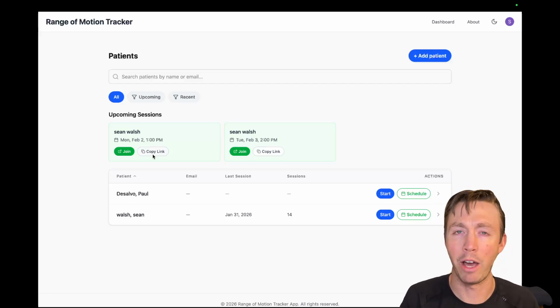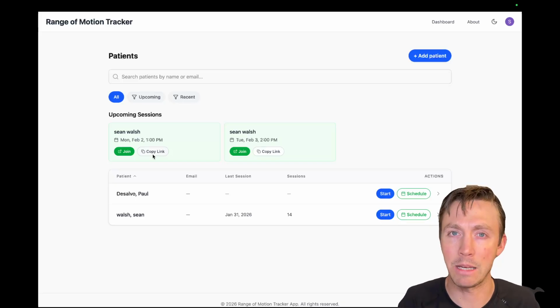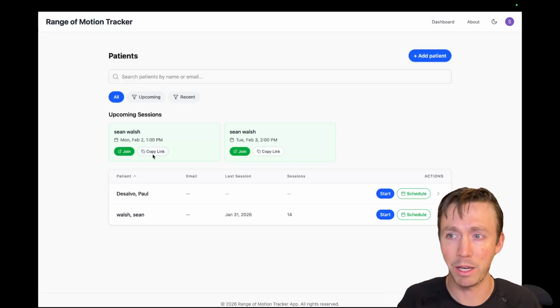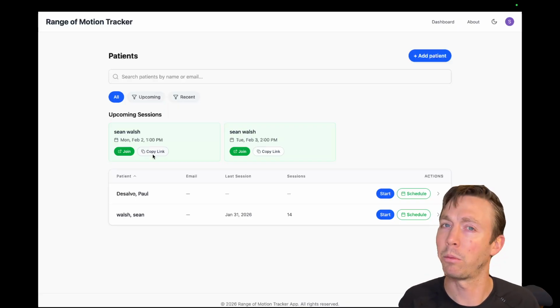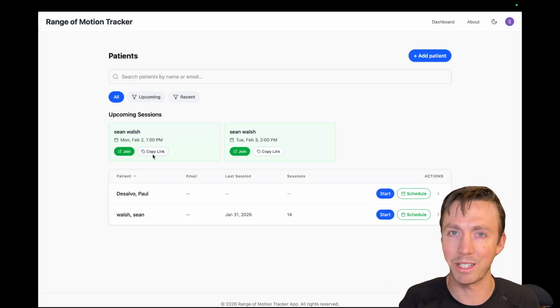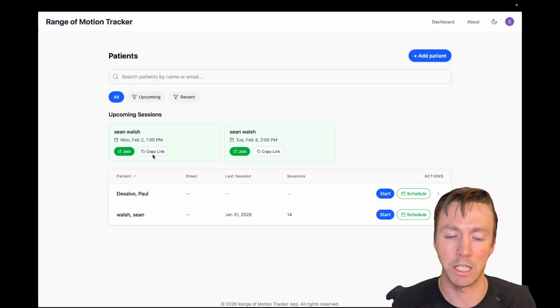We've trialed utilizing this software to send patients or clients an email. Most of the time it winds up in their junk box, and it just winds up being another form of communication that they're not really sure where it's coming from or where to look for. So we found the best case use for our software is to plug the link into your own existing email. That way the patients have this as a trusted source. Nothing's getting lost in transition.